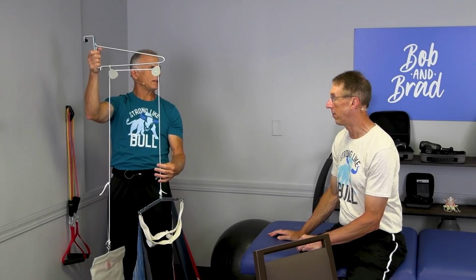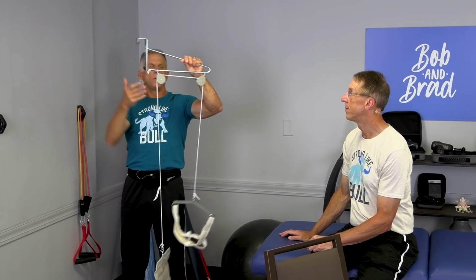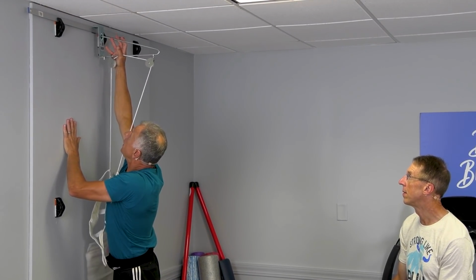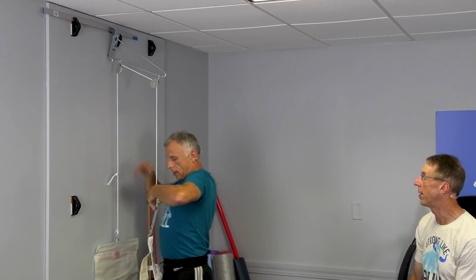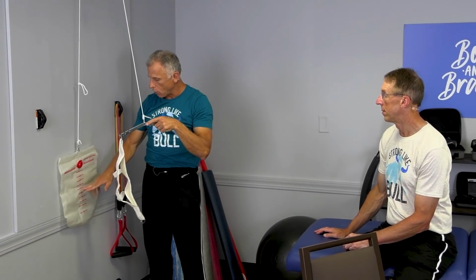So that's the difference. You get this frame, and these are like 20, 25 bucks. They're really very inexpensive. This goes in the door. We don't have a door, so I made a makeshift thing that you can see. It'll hook on the door like that. And this is the weight. This pulls down. You put water in there.